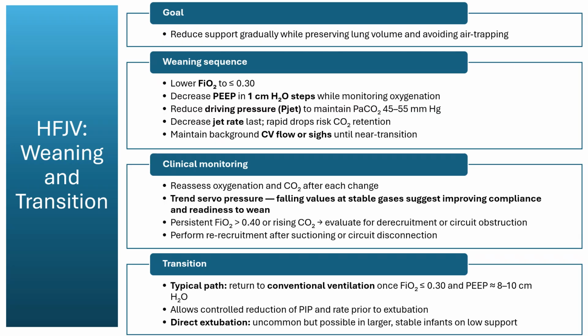Weaning from the jet requires patience and close monitoring of both gas exchange and mechanical feedback. Small, deliberate changes maintain recruitment and allow the lung to recover without reintroducing pressure-related injury.